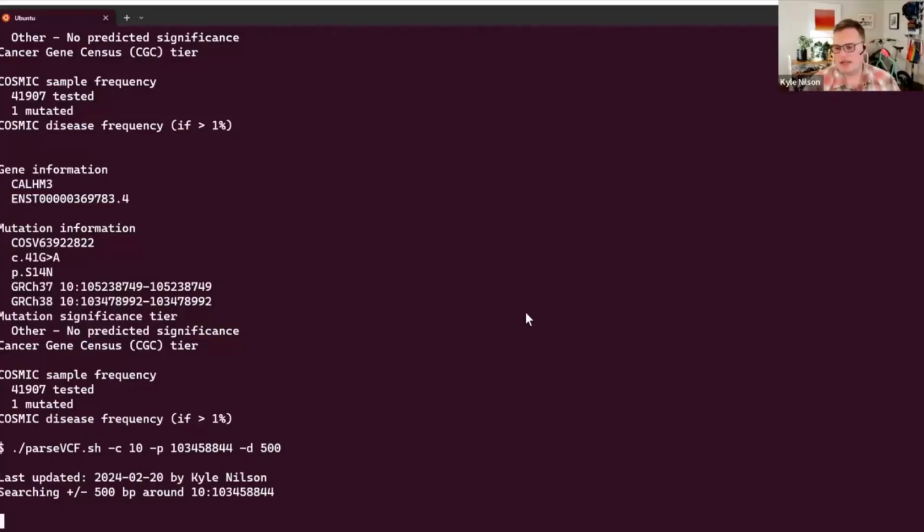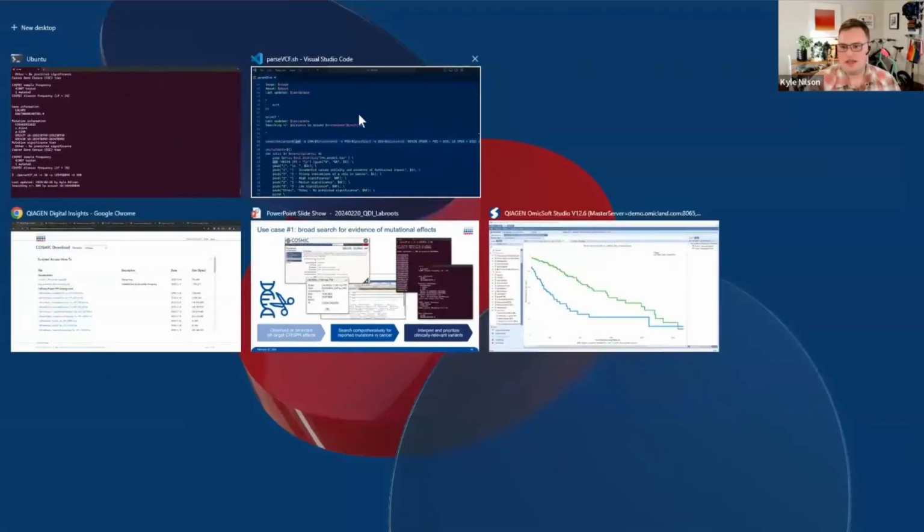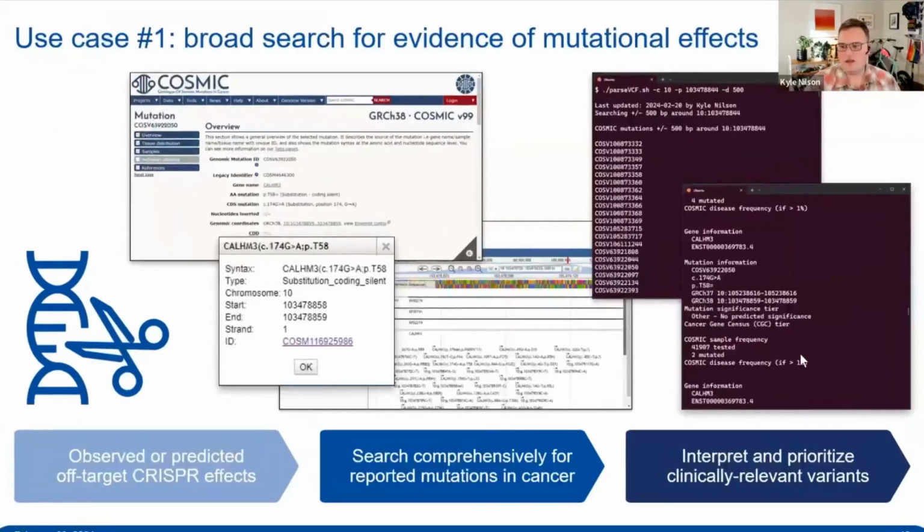This might take a second, but ultimately, the main thing to point out is that you have the ability to look at all of the variants within a given region programmatically, and you can easily pull out information related to ClinVar, gnomAD, and significance. You have access to expert interpretations for whether or not these are causal variants. And you also have access to actionability data, which can help link a given mutation to known drugs as well as known specific cancer types.